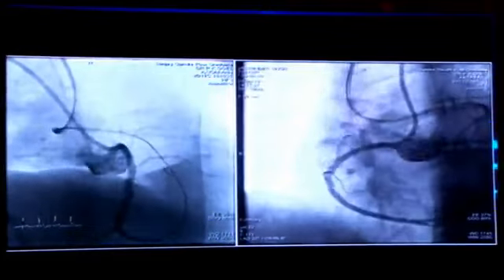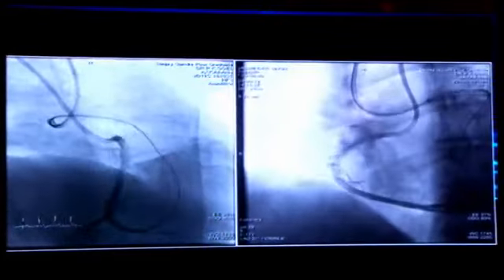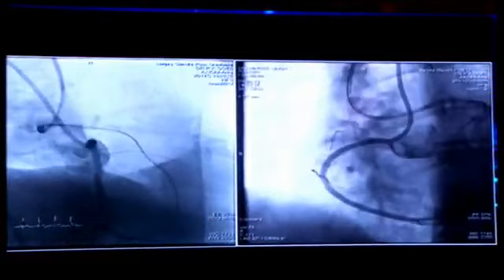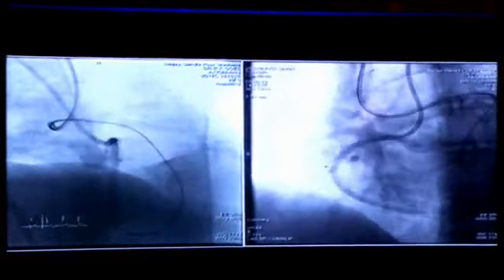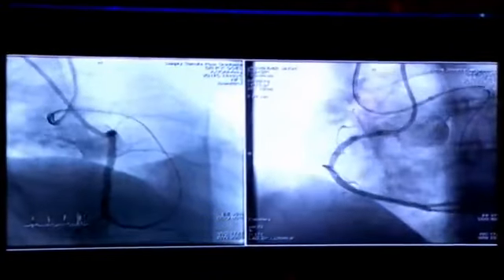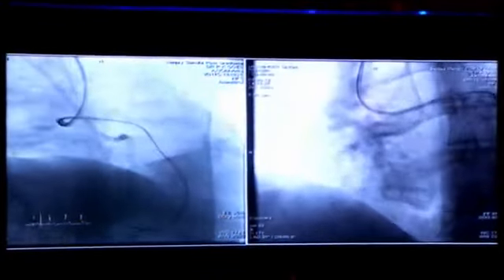So now you see it. Looks quite good. There is some proximal lesion, a little gap where we are just going to add one more stent. But excellent demonstration of retrograde wire coming in the true lumen.